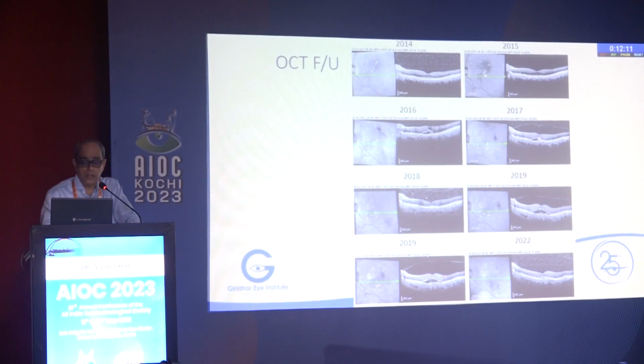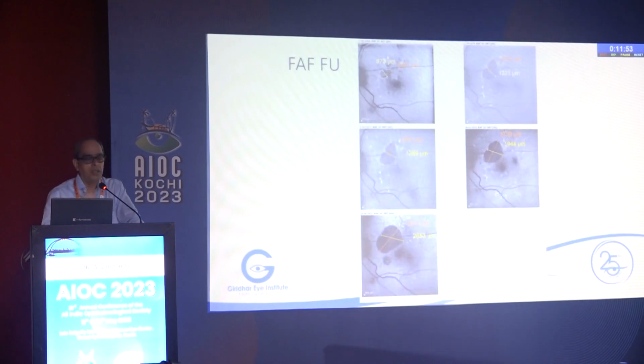And why is it wet? It's either a CSR or a type 1 neovascular membrane. What you see is serous macular detachment, isn't it? But along with the serous macular detachment, you also see an irregularity of the retinal pigment epithelium. And in any elderly patient, 80, 82 years old, this is most probably a diagnosis of wet age-related macular degeneration. Now, what do you see in this particular photograph here?